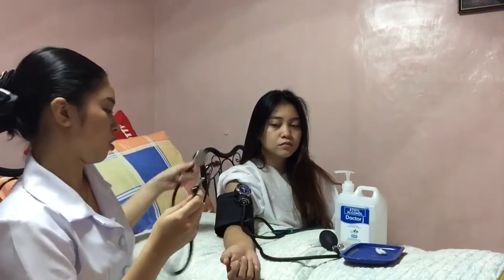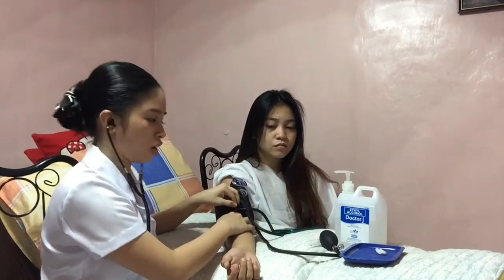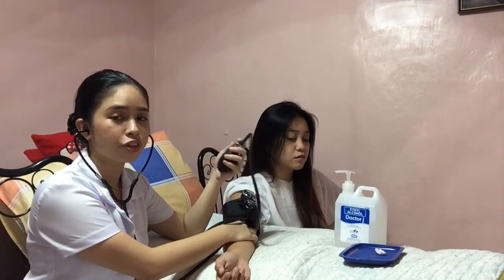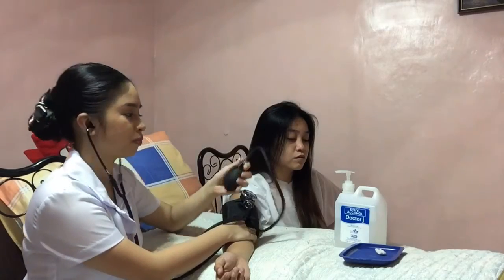Now, clean the earpiece, the diaphragm, and the valve. Then put the earpiece in your ear, ensure that it hangs freely. Then put the stethoscope on the skin and not on the clothes. Hold it with your 2 fingers. Then now, let's auscultate the client's blood pressure. Pump up the cuff until the sphygmomanometer reads 30 mmHg above the point where the brachial pulse disappeared.